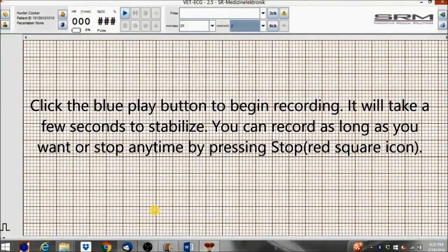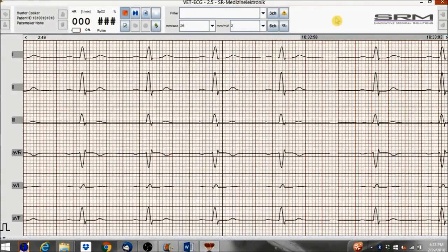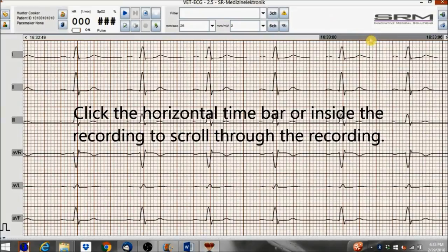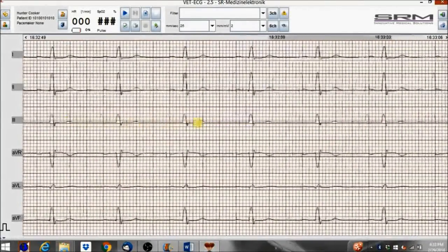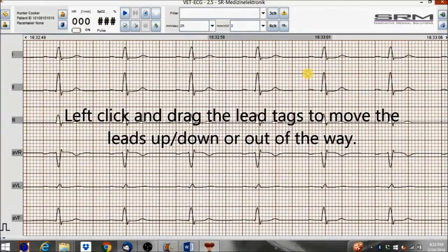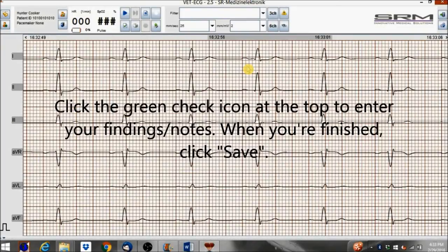It will take a few seconds to stabilize. You can record as long as you want, or stop any time by pressing Stop — the red square icon. Click the horizontal time bar or inside the recording to scroll through the recording. Left-click and drag the lead tags to move the leads up or down or out of the way.